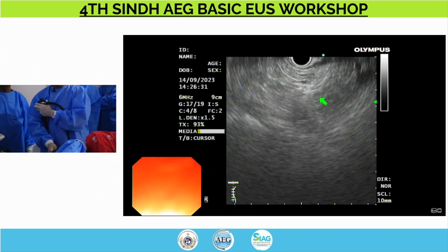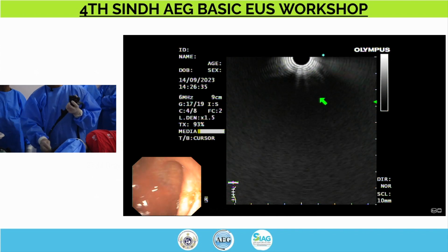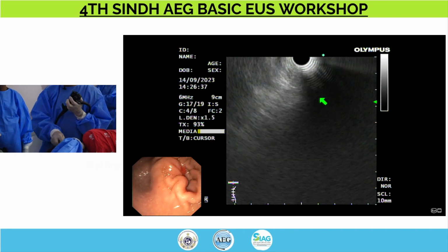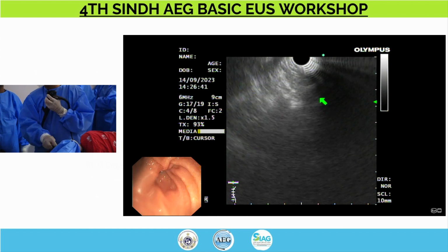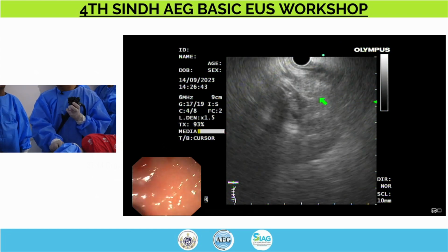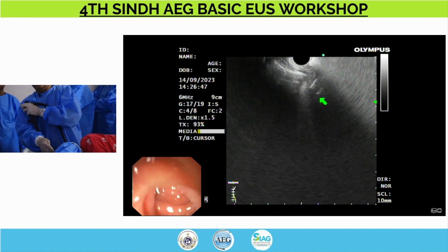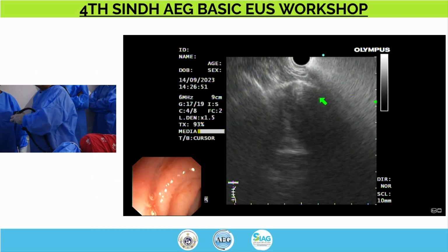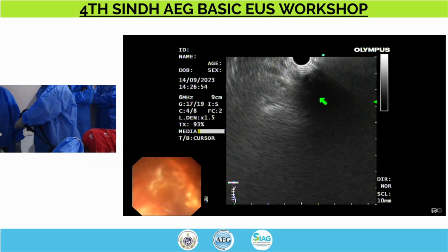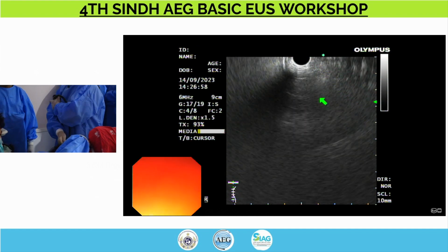If you fall back, you can always go back, and I can feel like that I fell back. So right now what I'm going to do is, I've seen the head, I've seen the uncinate, bile duct, pancreatic duct. Now I'm going to do that maneuver I mentioned, like a 20-second maneuver to see the whole pancreas in one go, and that would be the area where you see the neck of the pancreas from the third station.